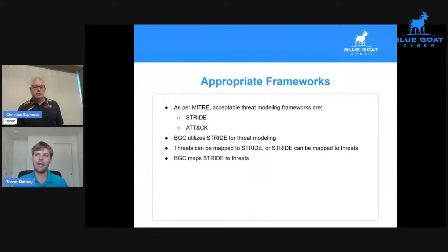So if we're looking at an individual problem, we'll say the issue is someone can access credentials stored in the database. We would say, what are the concerns here? Information disclosure, elevation of privilege. These are some of the threats for STRIDE. And so we would assign those to the individual threat. The alternative is we can take these threat categories out of STRIDE, so information disclosure, and think of anything that can happen to the device that would cause information disclosure, list them all under there. This also, in that case where we have database credential theft, that would apply to the same area under elevation of privilege.